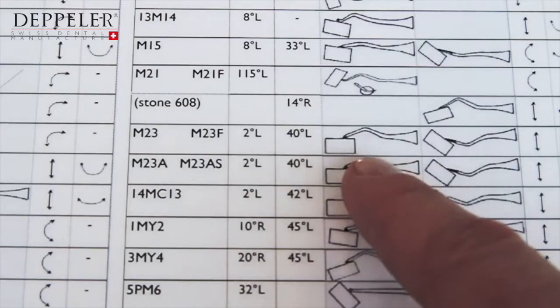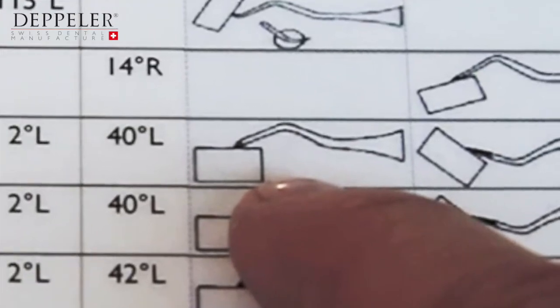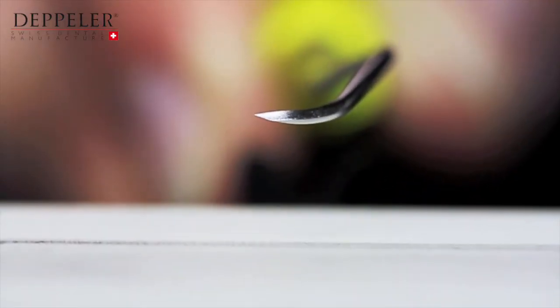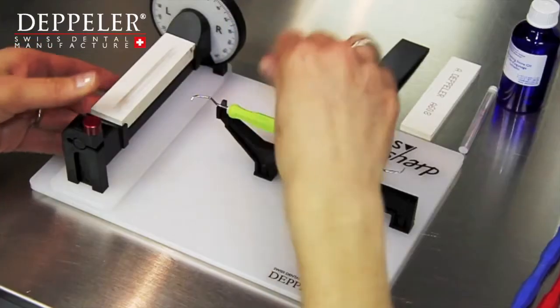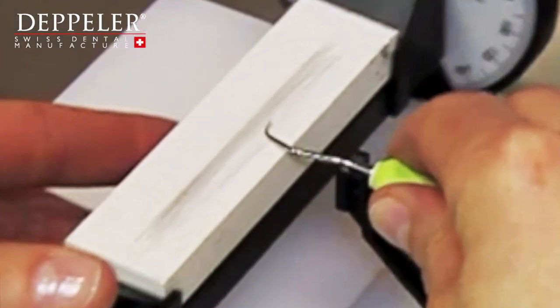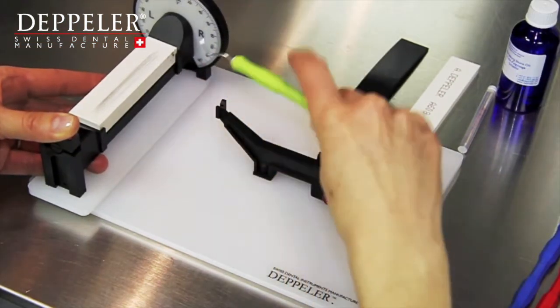Adjust the angle as indicated and block it by tightening the screw. Check that the angle you have adjusted corresponds to the cutting edge you want to sharpen. With this adjustment at 2 degrees, you have to lift the instrument to be able to put the blade on the stone. Check the movements to be made with the stone on one hand and with the instrument on the other. For the M23 scaler, turn the instrument on itself alternately to follow the curve of the blade and slide the stone from the bottom up following the rectilinear movement.